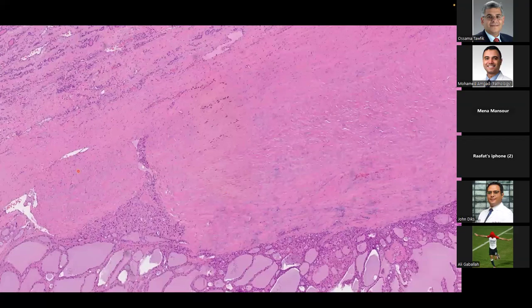Here again, you have this lesion with a very thick capsule. But notice here, you can't find the end of the capsule, right? It's kind of, maybe this is normal tissue. You can see here that the tumor is going through the capsule, and then it kind of pushes onto a vessel. And again, you get levels.